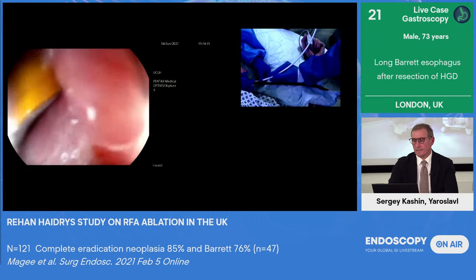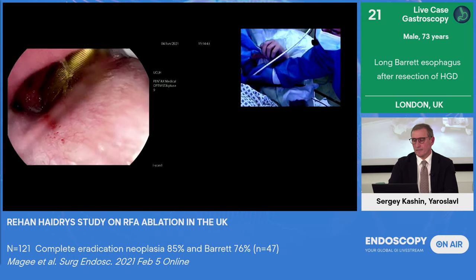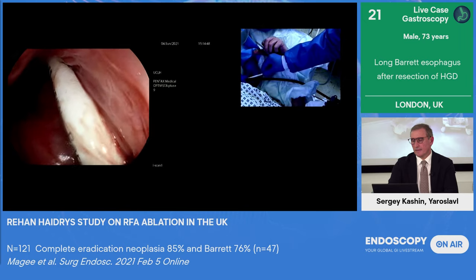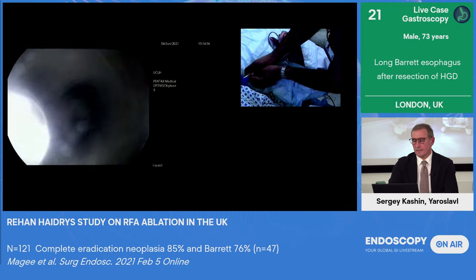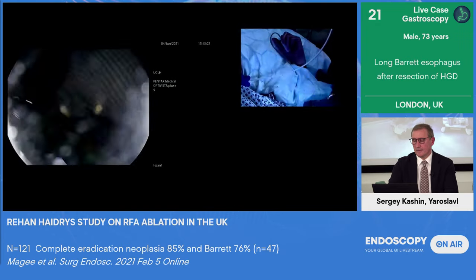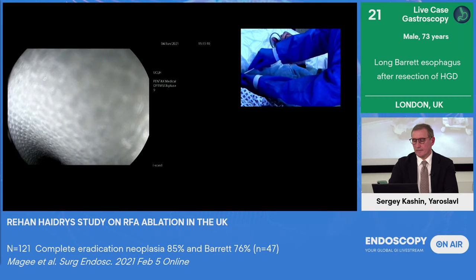I'm going to push the catheter down a bit more. Further. Yeah. Ooh. A bit of trauma here at the back. Okay. Maybe just pull the scope back here. Okay. Just get the scope out. Can we get a bit of negative traction on the wire? So you want to try and put that in with a bit of negative. Keep the catheter straight. Bring his chin up a bit, guys. Thank you. And let's pull back on the wire a bit, please. And down you go, Vinay. That's nicely done.